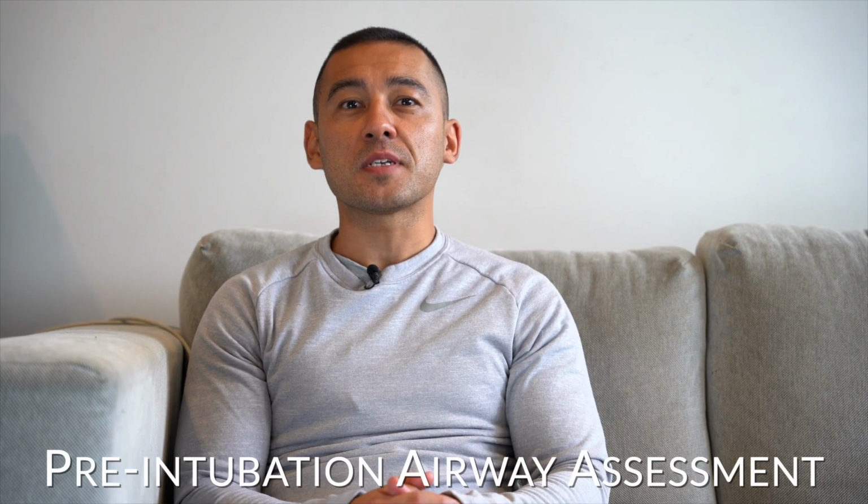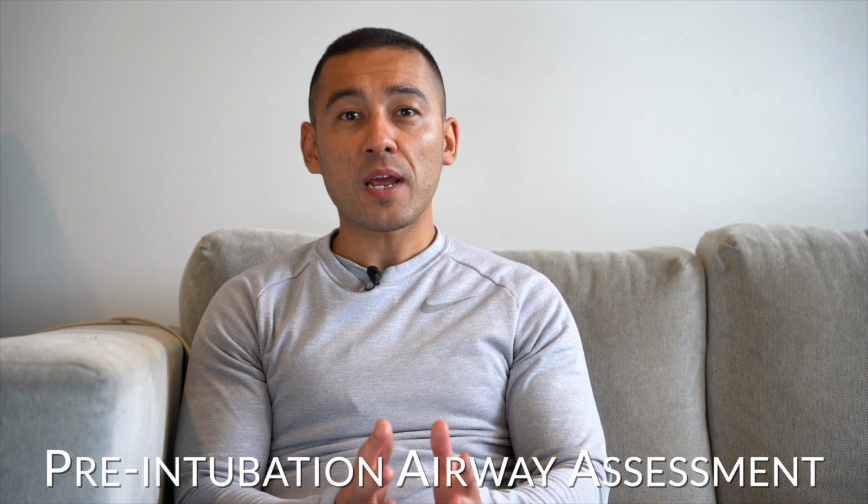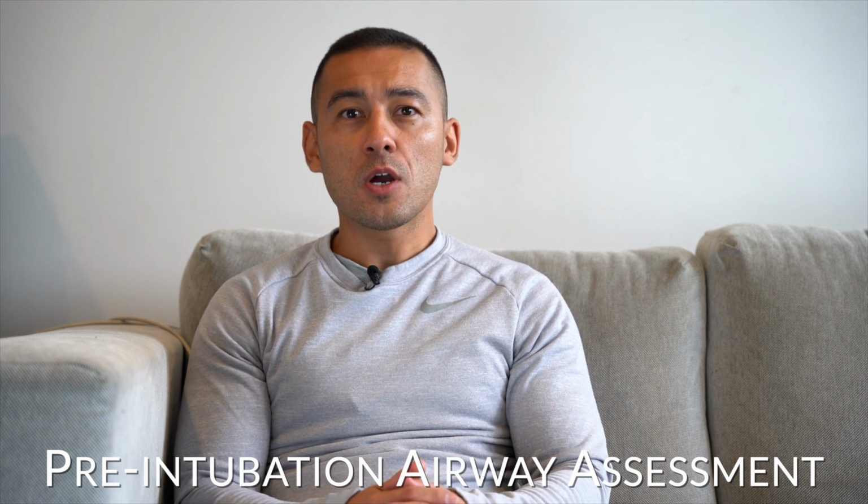Hi everyone, my name is Leonard and today I'll be demonstrating the preparation involved when performing a drug-facilitated intubation. Conducting a pre-intubation airway assessment can assist in identifying patients who have difficult airway anatomy or other characteristics, which may make managing their airways challenging.